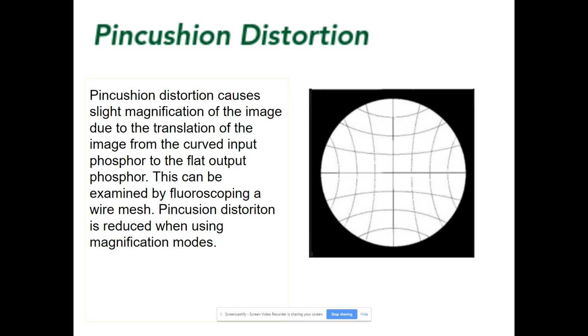And magnification mode does just that. It magnifies the image. So you're cutting some of the anatomy when you magnify other parts of the anatomy, right? Because you only have one monitor that's one size. So if you magnify anything on there, it's going to expand as much as the borders will allow on an image. Everything doesn't just get bigger.